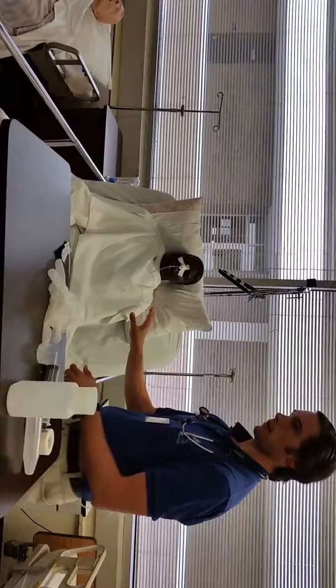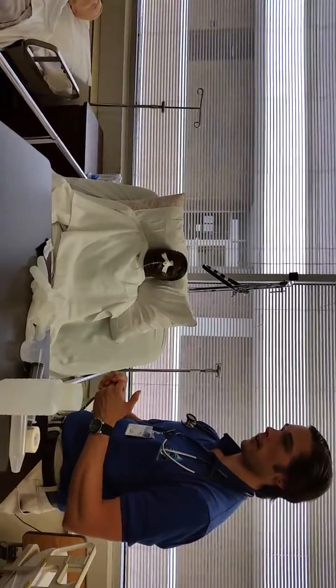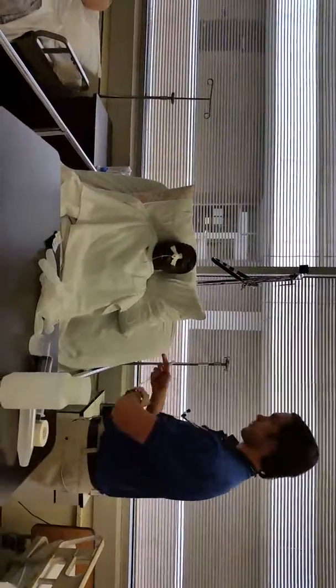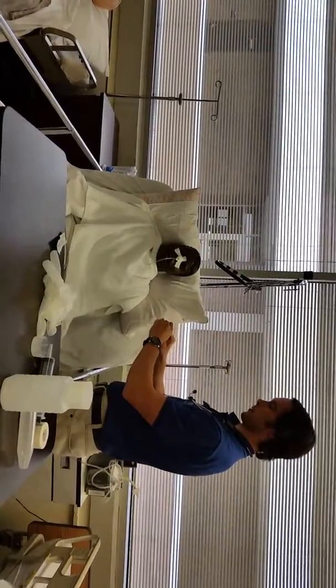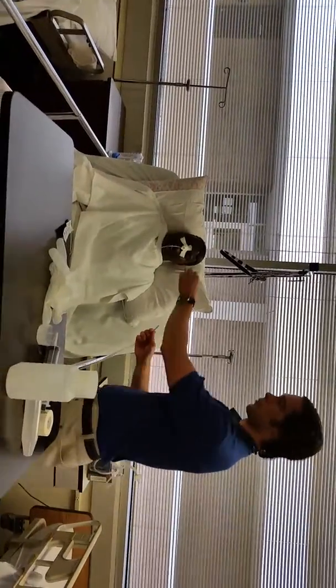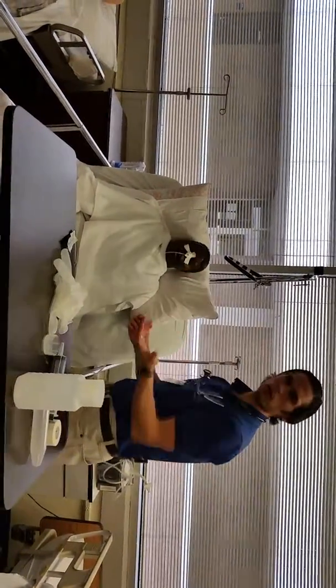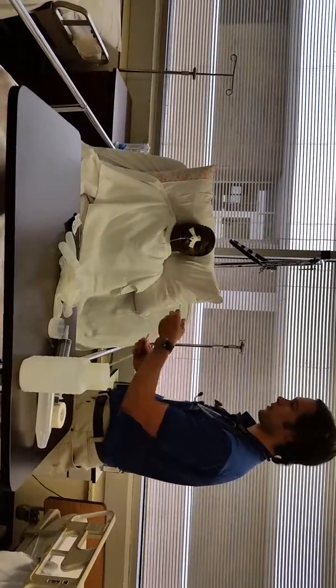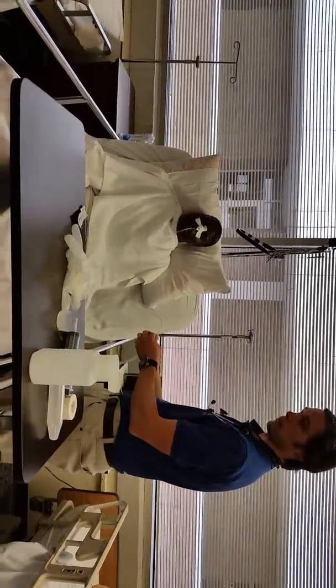So that's like that. Then I would connect it to low setting of suction, and come back and do oral hygiene every 2 to 3 hours because they are NPO usually with this, so I clean their mouth every 2 to 3 hours.